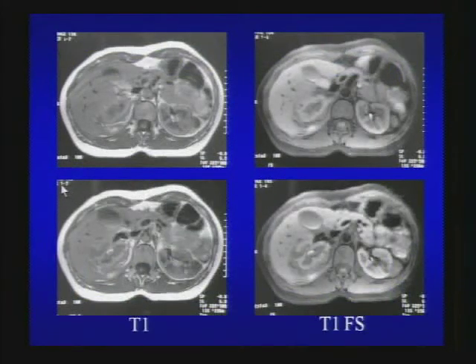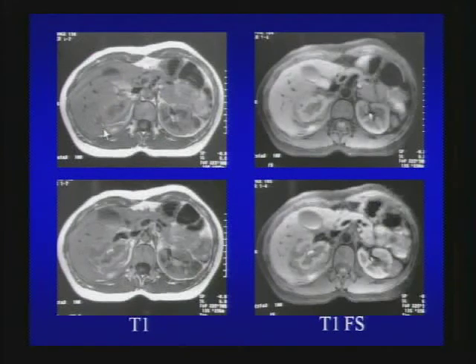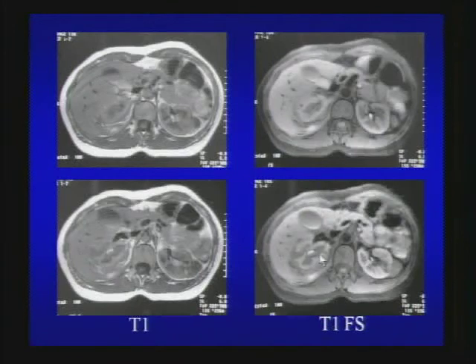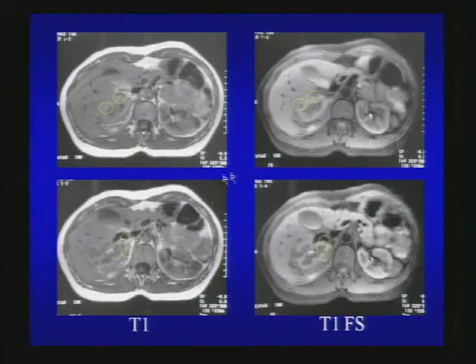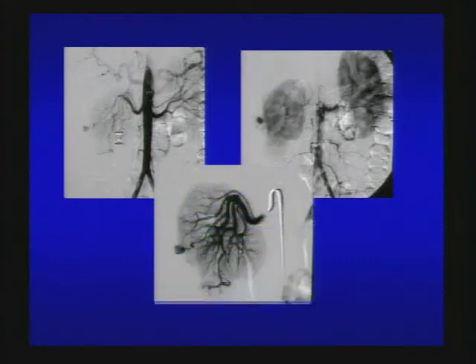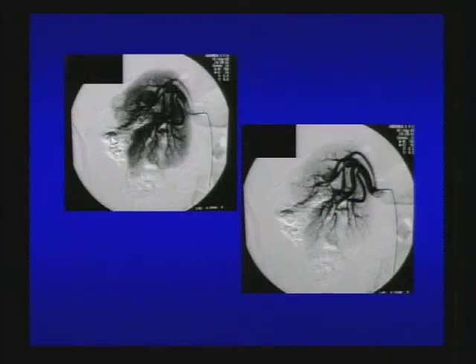Here's another case: multiple tiny hyperintense lesions from the right kidney. Could it be hyperintense proteinaceous cysts or fatty lesions? On T1 with fat saturation these masses demonstrate signal loss — so these are tiny multiple angiomyolipomas. Angiomyolipoma is very vascular and often demonstrates pseudoaneurysm, which is why they bleed. The treatment is coil embolization.